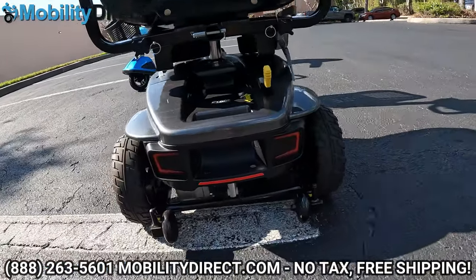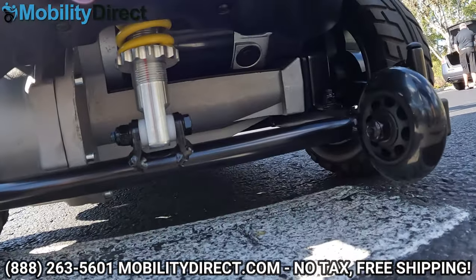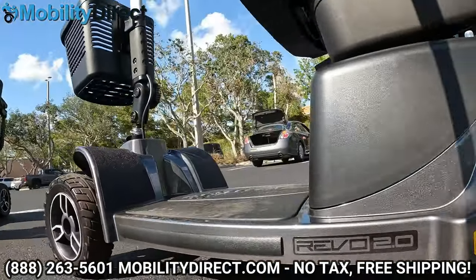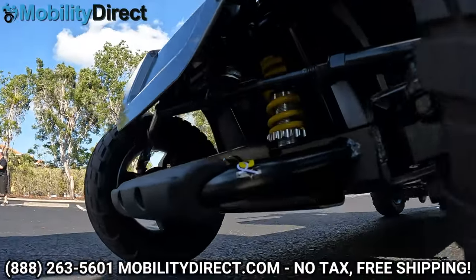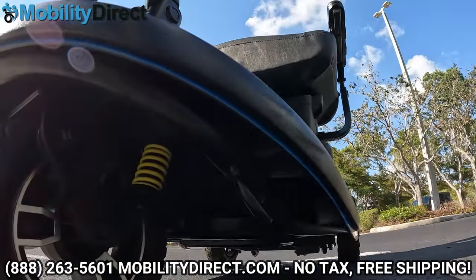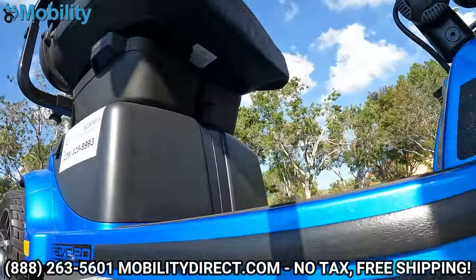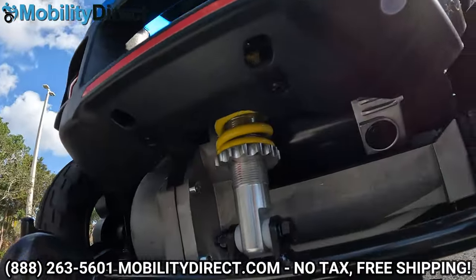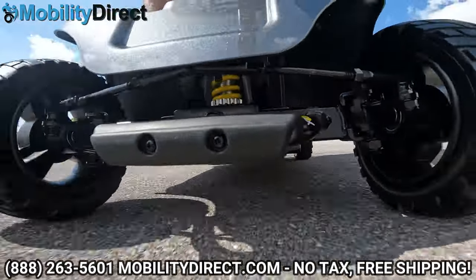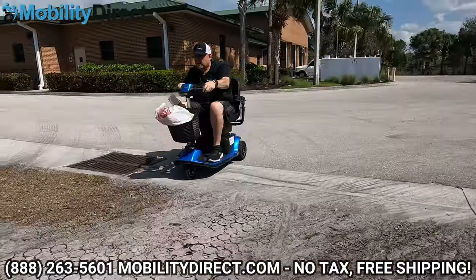It has anti-tip wheels in the back, and both the four-wheel and three-wheel versions have front and rear suspension. On the four-wheel version, you have one big independent suspension coil on the front and rear, whereas on the three-wheel version, you have two smaller suspension coils on each side of the front wheel and the same single extra-large suspension coil on the rear. There's a big, powerful motor, and both units come with an excellent parts warranty and a one-year in-home service agreement, backed by Pride Mobility.